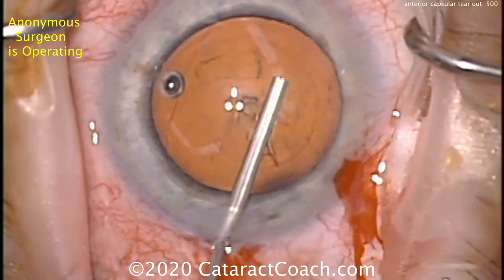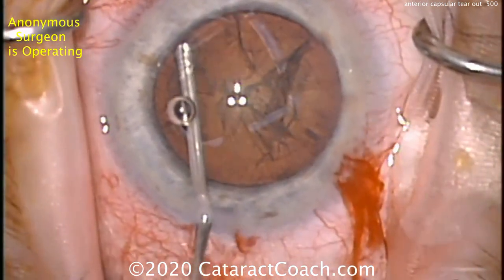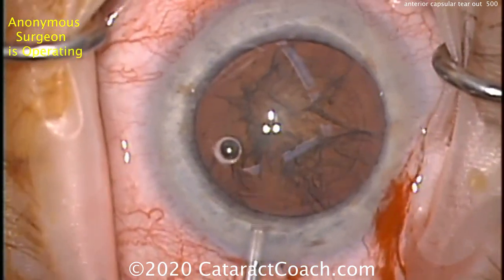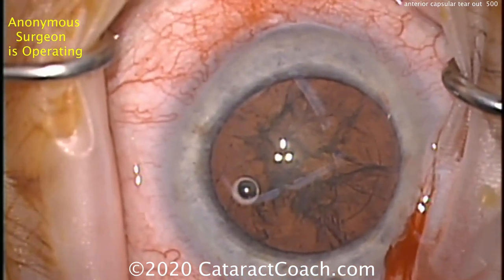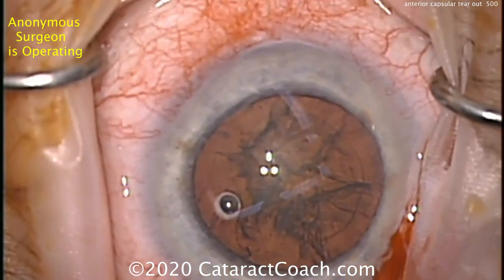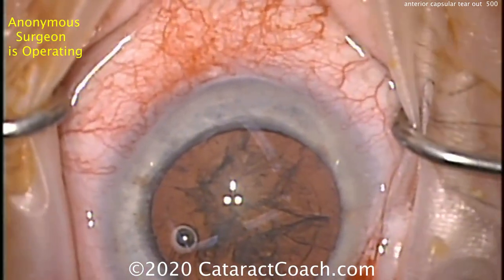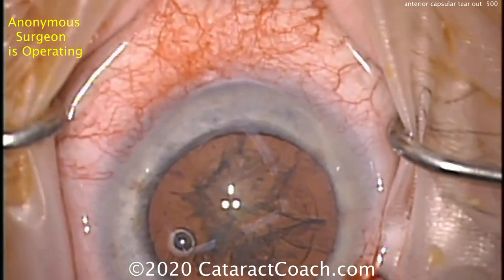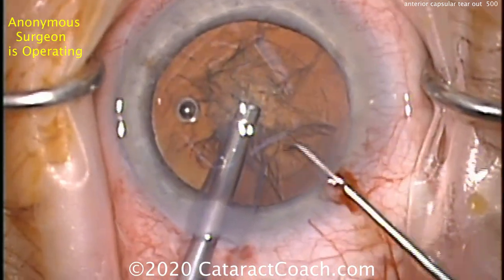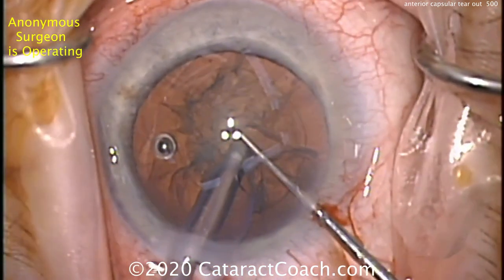So tell me, when does that happen? A little hydrodissection being done — that looks very reasonable — and rotating the lens nucleus beautifully. So far, so good. The question is, when does this radialize? If you have a small rhexis and you're trying to do a nuclear flip or prolapse it out of the bag, that can cause pressure, but that's not the case here. So we're going to wonder again where we're having the issue.